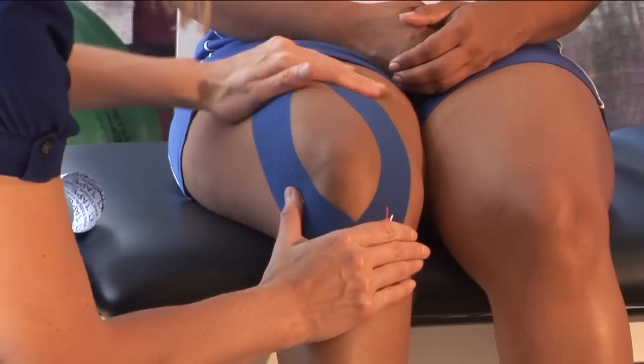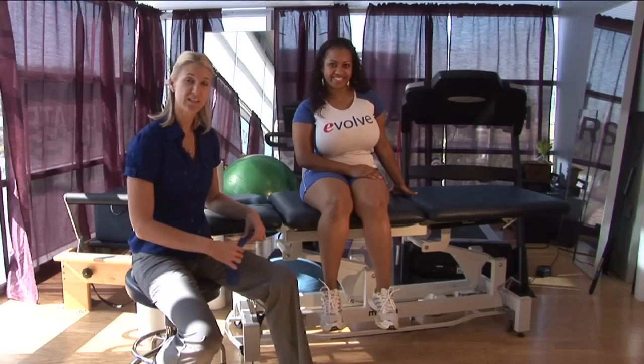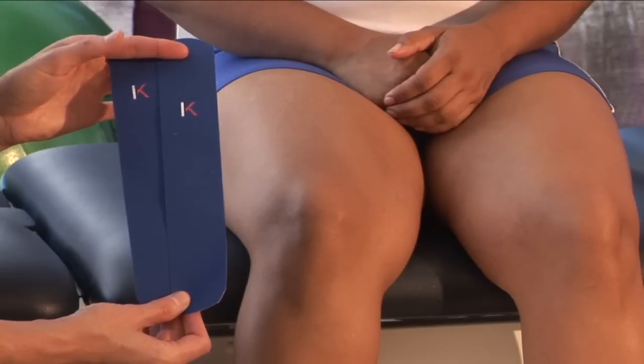Hi, I'm Tara Polak, physical therapist at Evolution Physical Therapy, and I'm here to teach you how to tape a knee for support. I like to use kinesio tape, or KT tape.